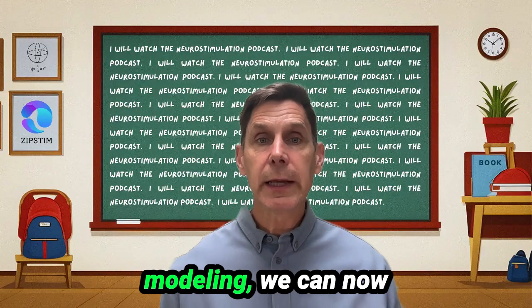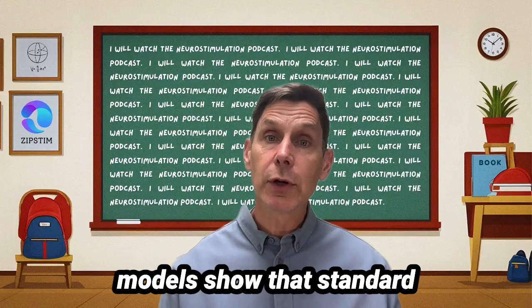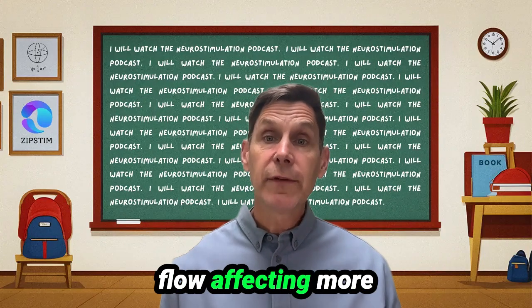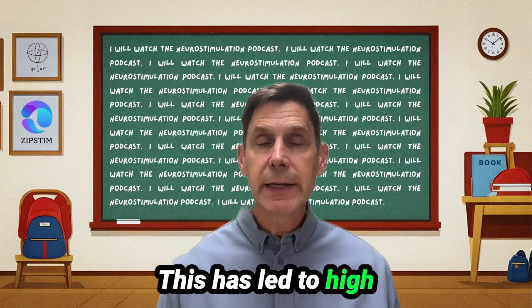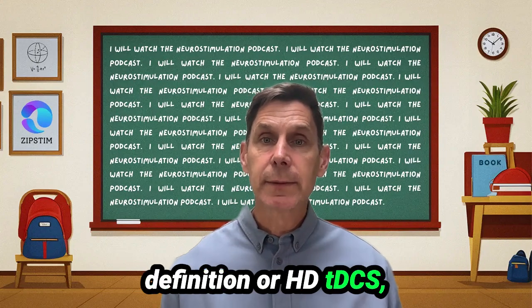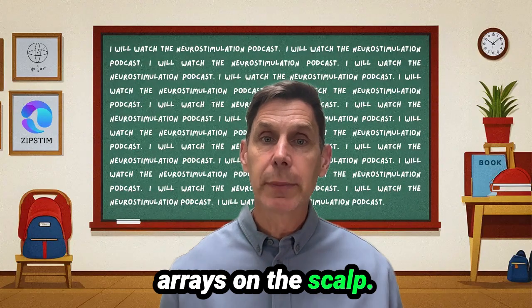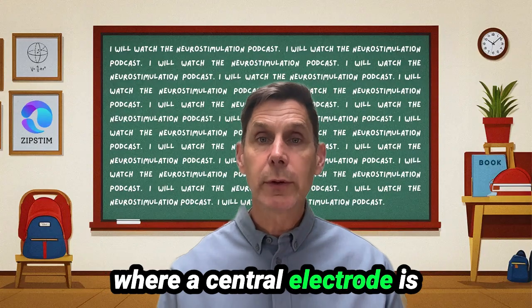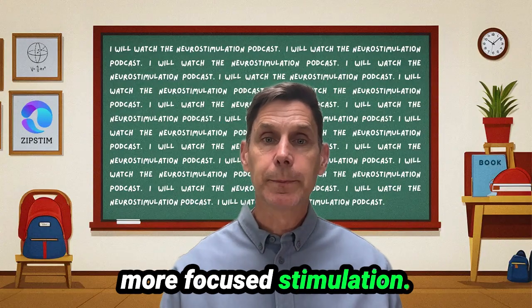Thanks to computational modeling, we can now visualize how electrical current flows through individual brains. MRI imaging-based head models show that standard electrode montages often produce diffuse current flow affecting more than just the targeted underlying brain region. This has led to high definition or HD tDCS, which uses small gel-based electrodes in multi-channel arrays on the scalp. The most well-known configuration is the 4x1 ring, where a central electrode is surrounded by 4 return electrodes, allowing much more focused stimulation.